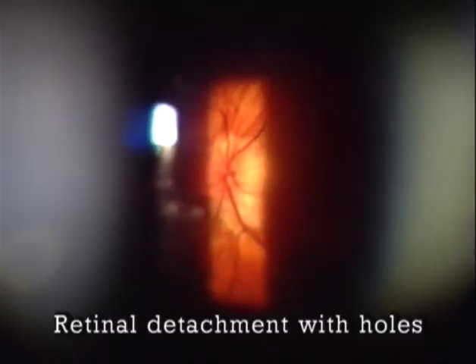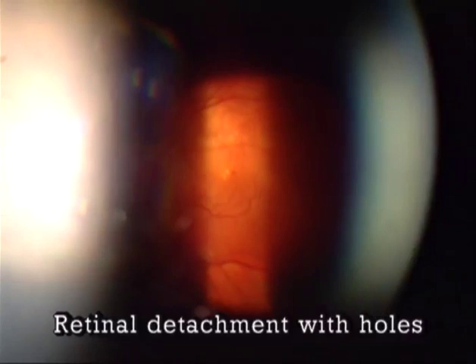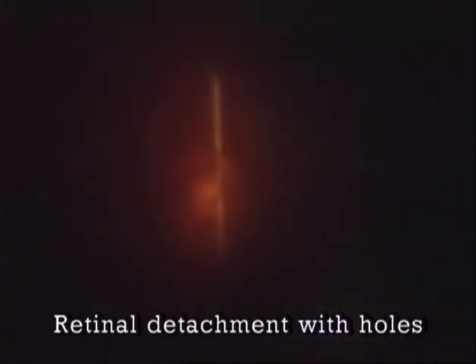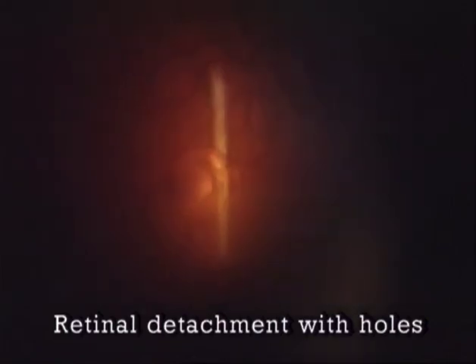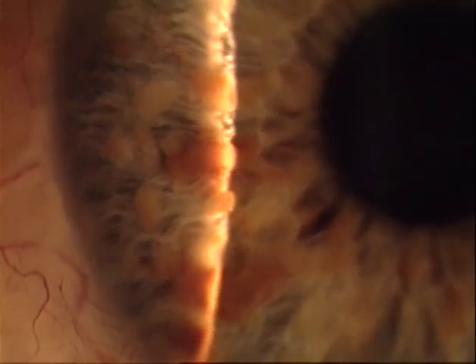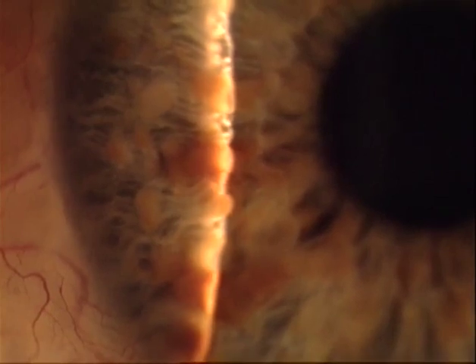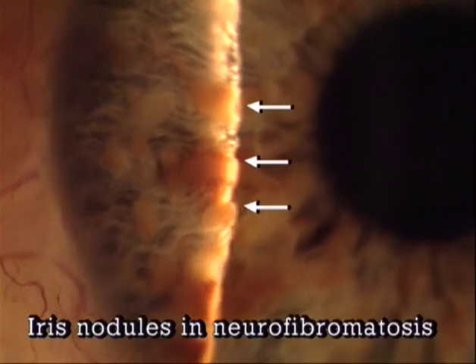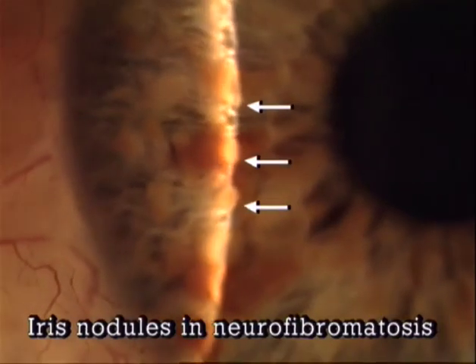At the retina, here a wide-angle view shows the detachment of the perimacular retina. A detail analysis of the macular area proves the existence of two retinal holes by the interruptions of the narrow slit. In the iris, the optical knife reveals any surface irregularities. As shown in this example of an iris in neurofibromatosis, the abnormal iris nodules become clearly visible by their circular outlines.